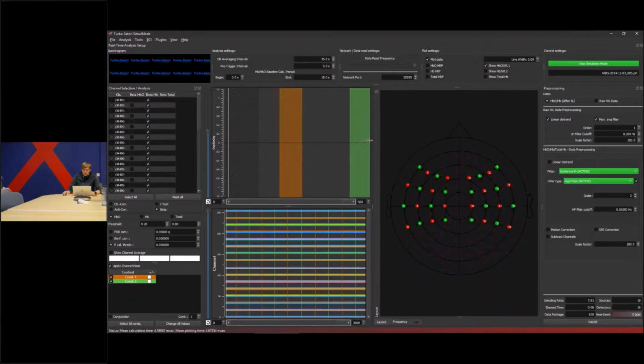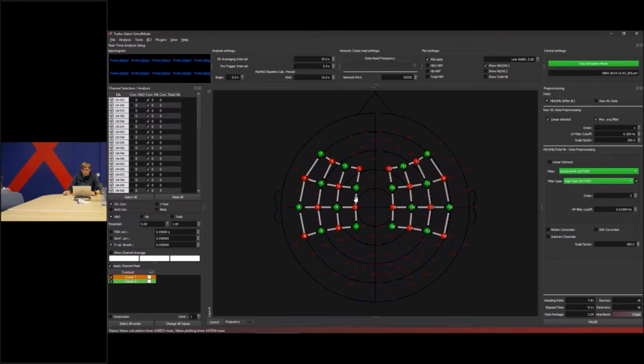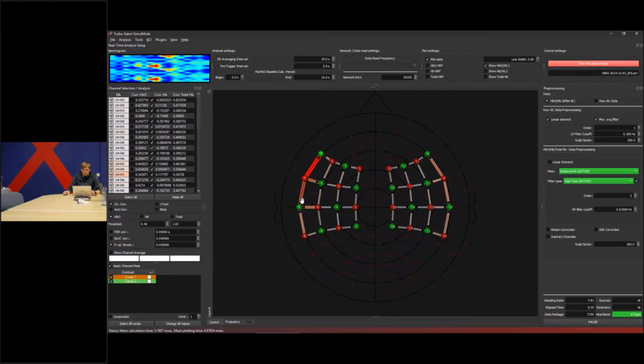And if you look at the channel correlation, you can see here now in this bigger setup that there is a different range of these channel correlations, which show you that there seems to be a clear pattern more in the central, which is also expected, and a lower pattern in the sides of the head. So you can just click these channels and then you see in the correlation value changed where the patterns are.